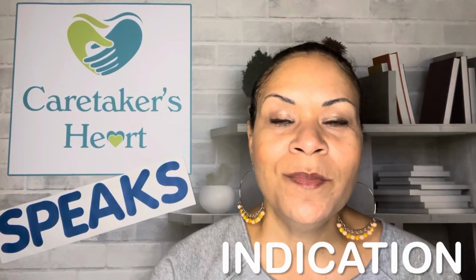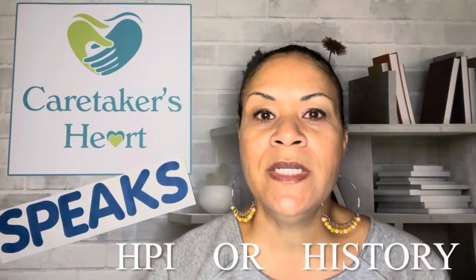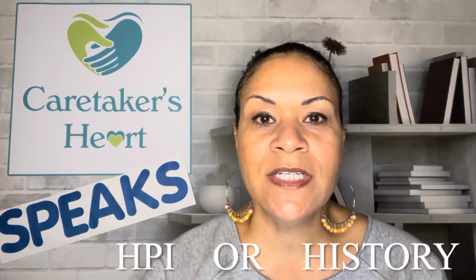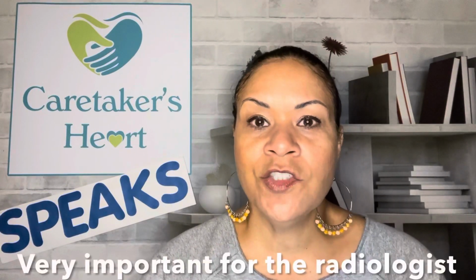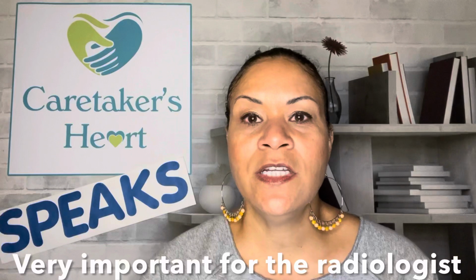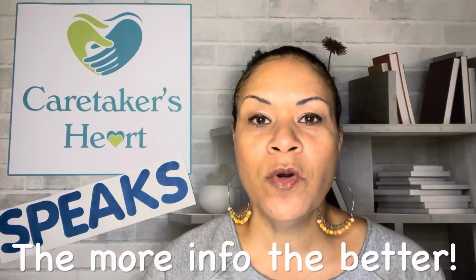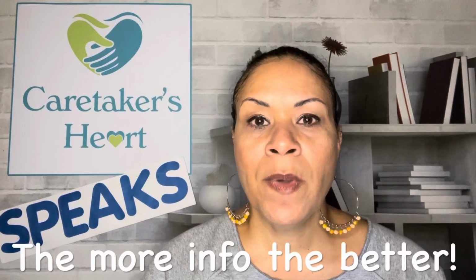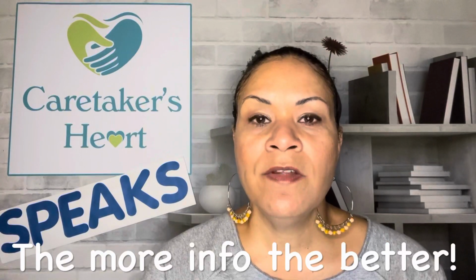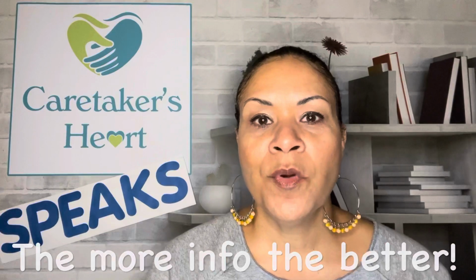The next section of my mammogram was entitled Indication, but it could be entitled History of Present Illness, or it may be just history. And that section is very important because it gives the radiologist an idea of why you're having the mammogram. It's especially important for your provider to write in information about the symptom you're having, the lump you're having, your family history, and any other pertinent history.